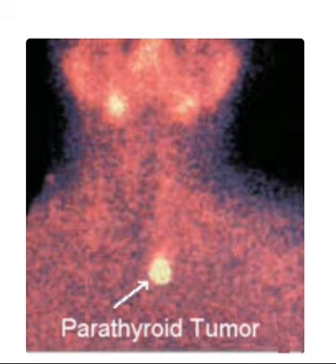Thanks in part to a Sestamibi scan, an individual who displays HPT symptoms can identify which gland is malfunctioning. During a Sestamibi scan, the body absorbs a radioactive agent that travels to an overactive parathyroid gland, and a doctor can use single photon emission computed tomography (SPECT) scans to produce 3D images of the parathyroid glands and other neck structures. If a doctor finds the radioactive agent is present in one or more of the parathyroid glands, then the surgery can become more focused and minimally invasive.